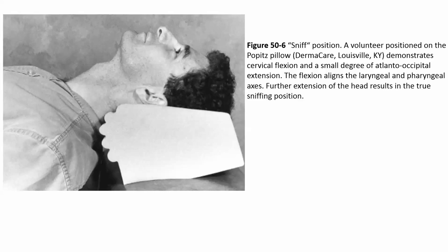Another airway device which I've never seen or used, but I present to you on this photograph, is an intubation pillow. And while it may not be perfect for everyone, you can see that it does elevate the occiput quite significantly, probably as much as you should for a true sniffing position, which is on average about 4 inches or 10 centimeters.